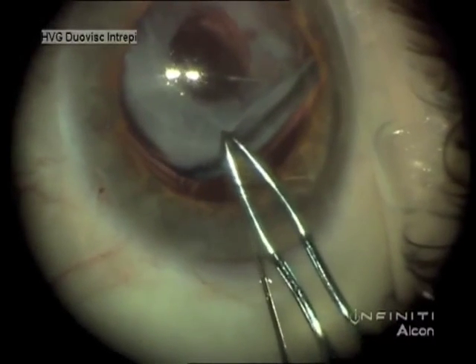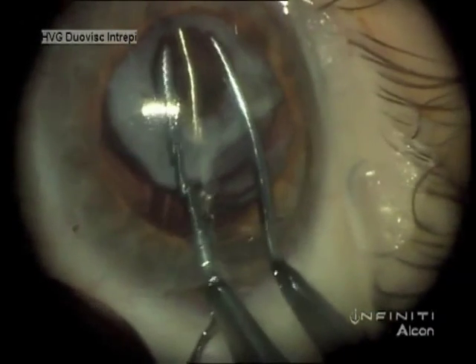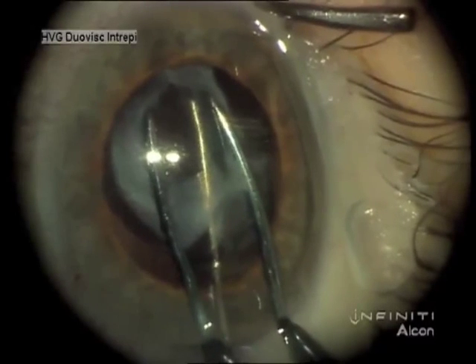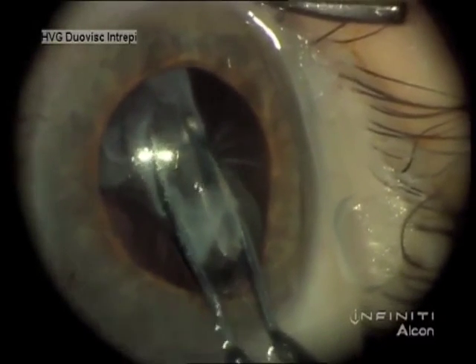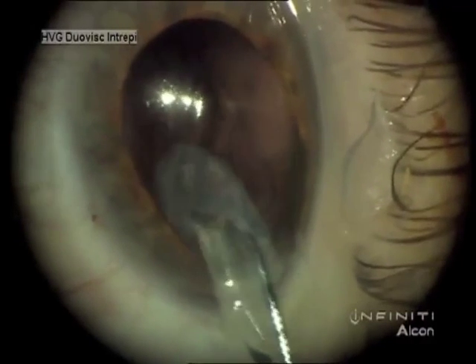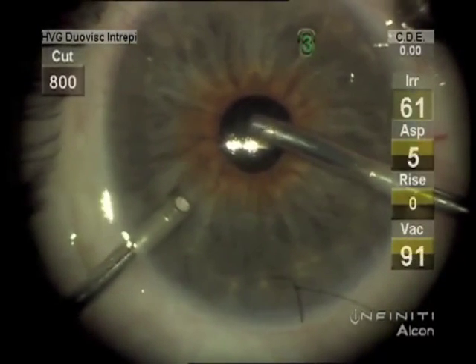So we're just going to fold this lens. I made the incision big enough for the anterior chamber lens, and that'll be big enough to get this lens out while it's still in the bag. A risk here is that the bag will open and you lose some cortical material into the anterior chamber or anterior vitreous. But this one did not — it came out intact.